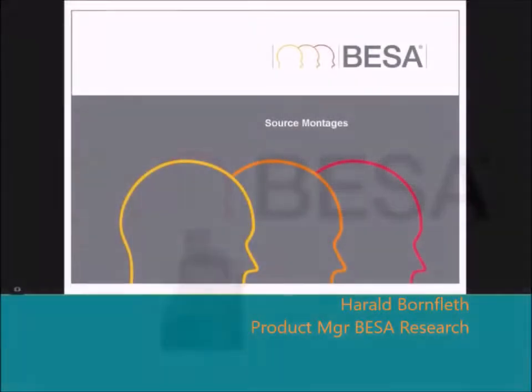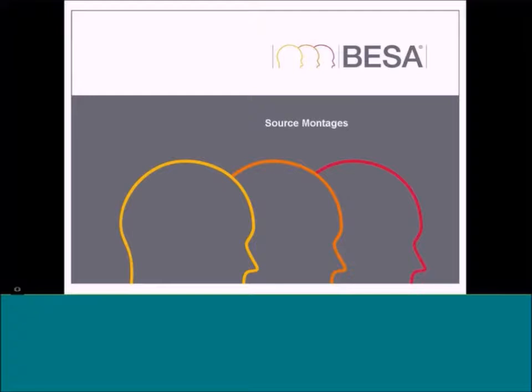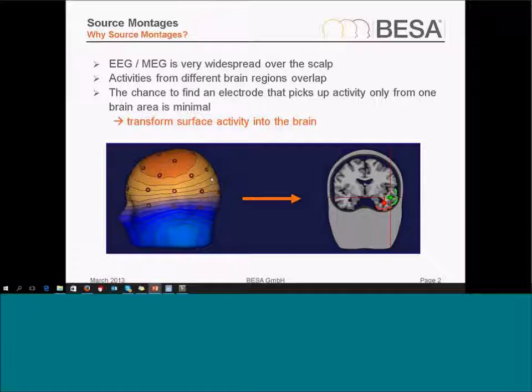We already talked about the principle that we can get from sensor space into brain space by using the inverse filter applied to the sensor data that we measured. And we can take this a little bit further. So first of all, a brief reminder, one dipole is the equivalent of some cortical patch.